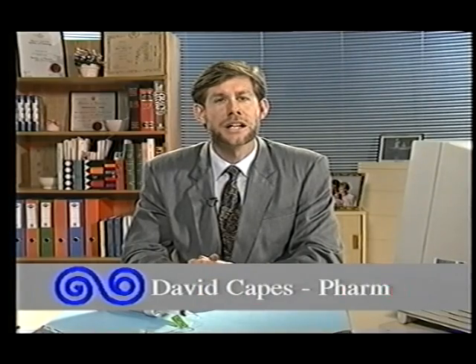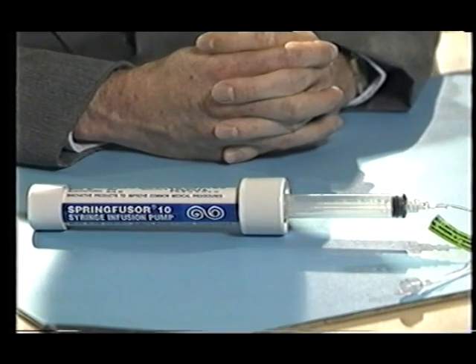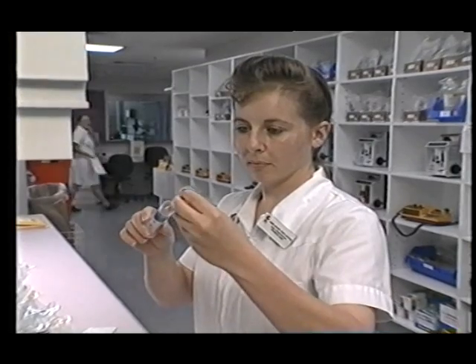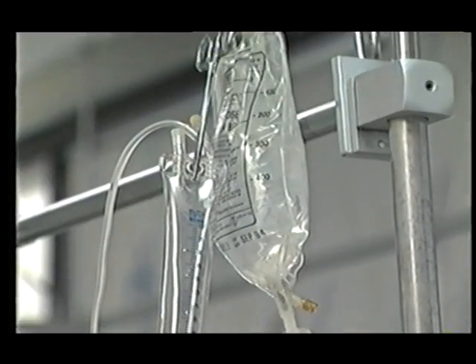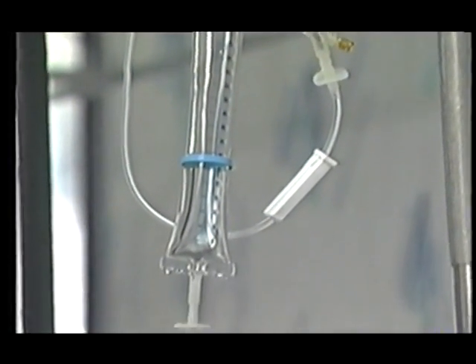Hello, I'm David Capes and I'd like to introduce you to the Spring Fuser, a new drug delivery device from Go Medical Industries. The Spring Fuser is a syringe pump designed to fill a niche in clinical practice between electronic pumps and manual bolus injection. It is less time consuming than manual injections, less expensive than electronic pumps, and compared to gravity infusions is more accurate and allows more mobility.